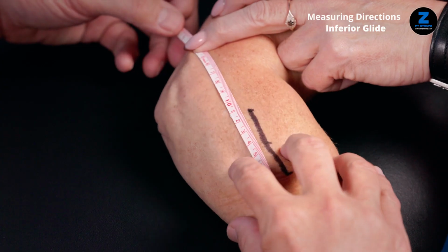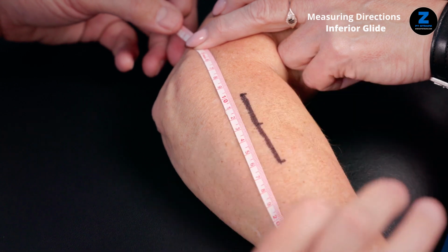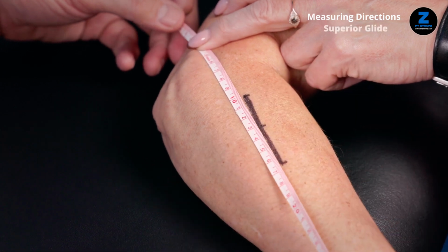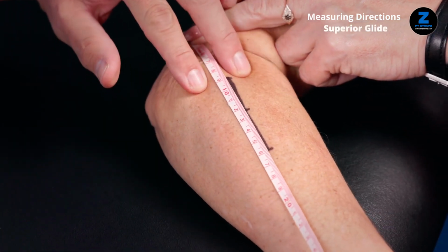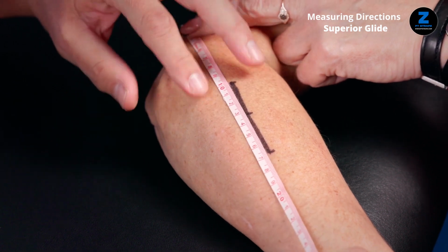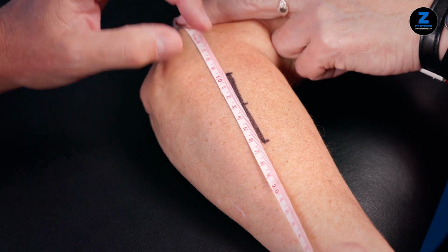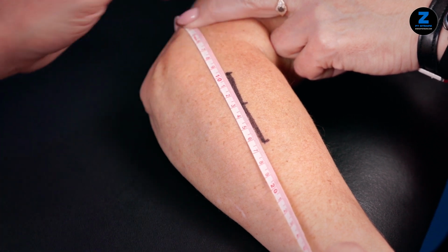Okay, pull. You can see that's a solid 1.5 centimeters for inferior glide. And I want to pull it superiorly. That definitely goes to 2 centimeters. See how quickly I can go through this and measure the excursion for all 4 very rapidly. So that's 2 centimeters for superior, 1.5 for inferior glide.